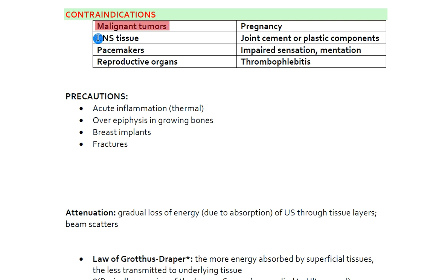We know that central nervous system tissue also would not be good to apply this to, especially in more superficial central nervous system tissue that could be exposed. So maybe you're thinking in the spinal region, if someone had a laminectomy where the bone is no longer shielding the spinal cord, that could be compromised. If you heat the area up, heat the nerve up, a neurovascular structure like that, it could cause changes in nerve conduction velocity, it could cause damage to the nerve, and other things along that line.